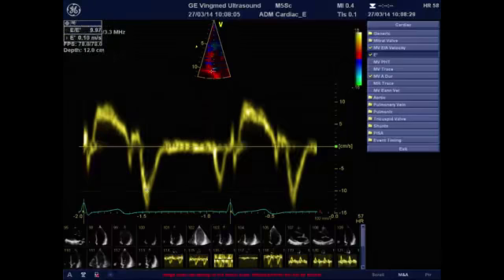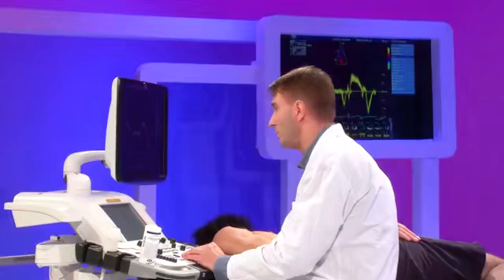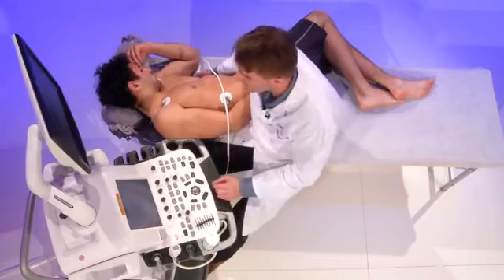I select the septal wall. You can also use the lateral wall, but then you should adjust your reference values. A normal E/E prime, or at least E/E prime which does not indicate elevated left atrial pressures in the septum, should be below 15.